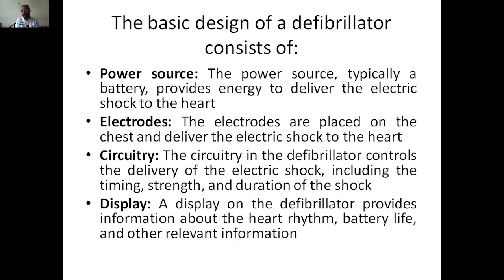When you are going for defibrillation, if the battery is at 10% or 5%, they cannot operate, right? So that's why the display should show the heart rhythm and how it is functioning, the battery life, and other relevant information like oxygen level. Everything will be there in this particular display.